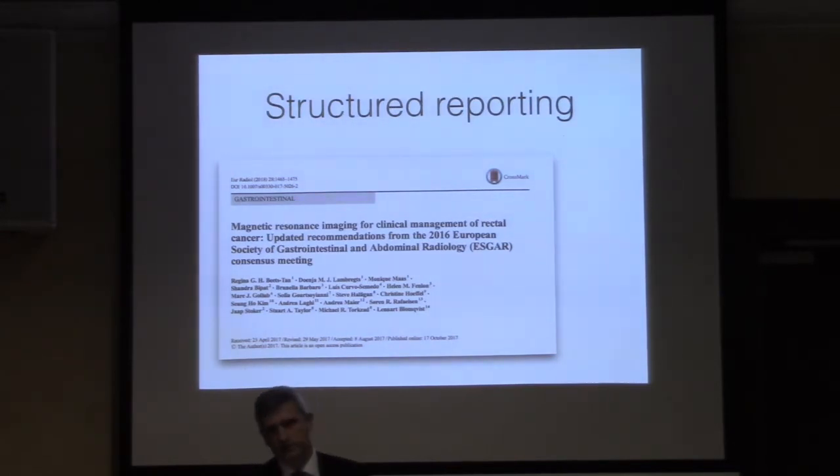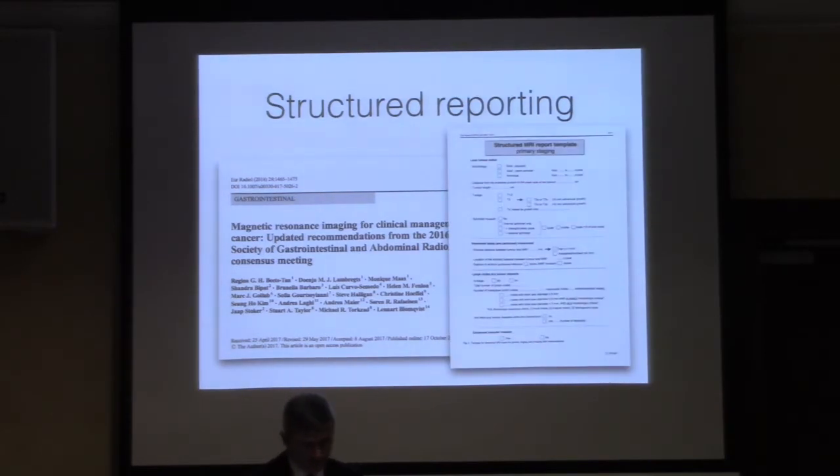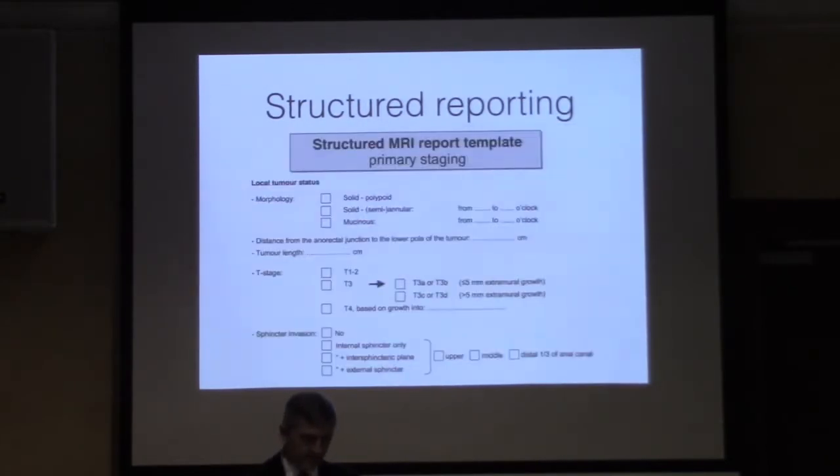The ESGAR again has got something which is European, has been evaluated. It has a very nice structured reporting format, which allows you to go through the factors which you need to consider that will guide us to the best information presentation. So I'll just take these in little bits at a time.